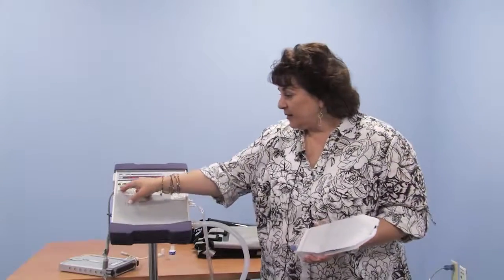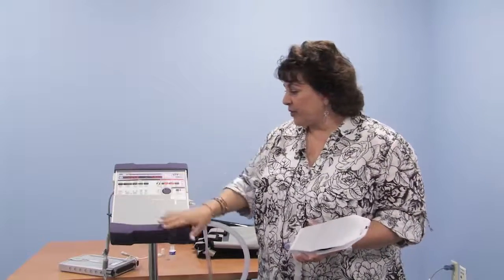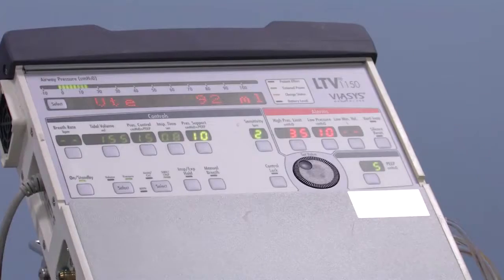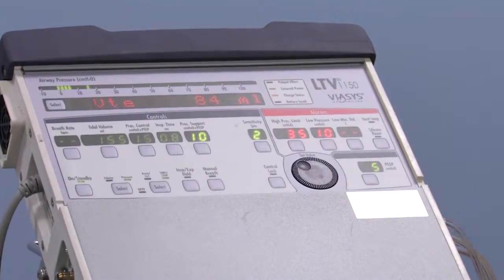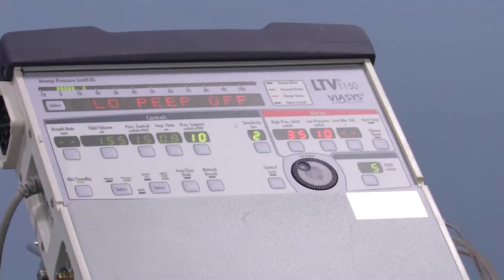But if your child is not on a breath rate, I'm going to turn the breath rate off. So all we see right now is the pressure support breath. So this patient, this child, is on what we would call straight pressure support. You might refer to it from terminology in the past as BiPAP, but it's bi-level support via tracheostomy tube, so that we're going to have a breath in and a breath out, a top pressure and a bottom pressure.